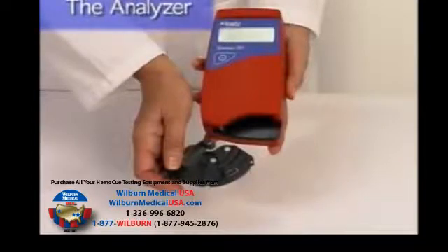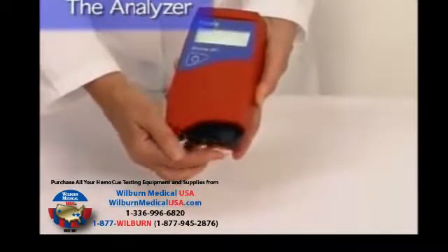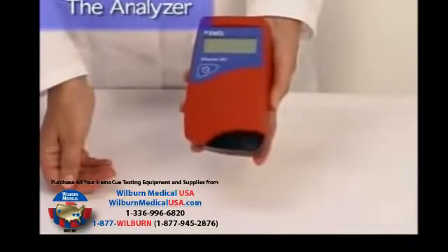The cuvette holder, used to move the cuvette in and out of the analyzer, has three positions. Number one: completely withdrawn for cleaning. Number two: pulled out loading position. And number three: completely pushed in for measuring position.